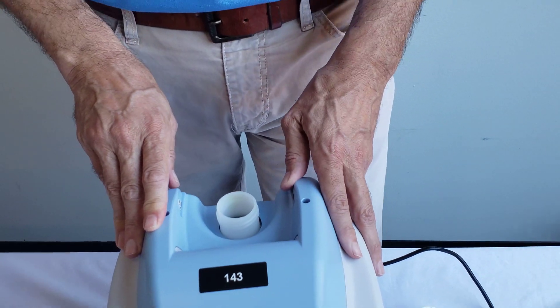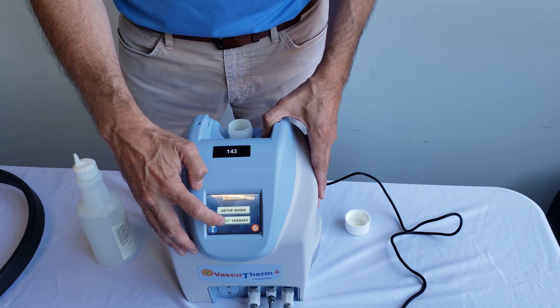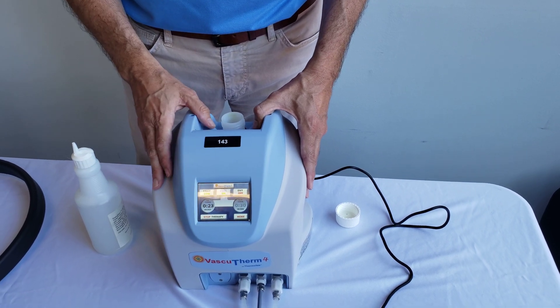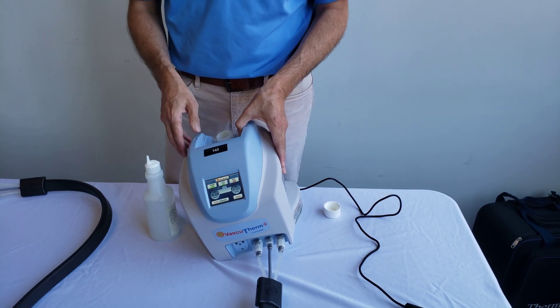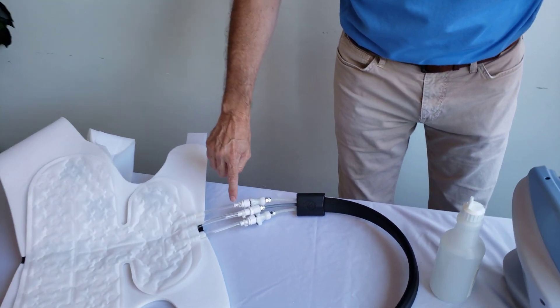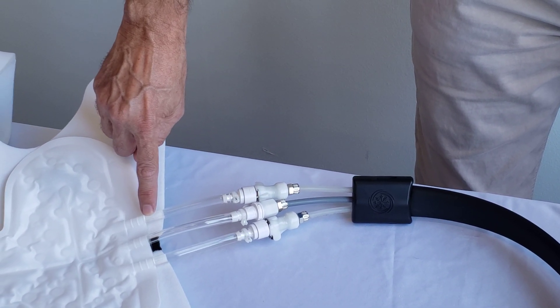Once you have a good amount of water, you want to prime it. Start the therapy and tilt it to the left a little bit just so it gets the water flowing, and then at that point you can see that it's actually now getting a good flow.